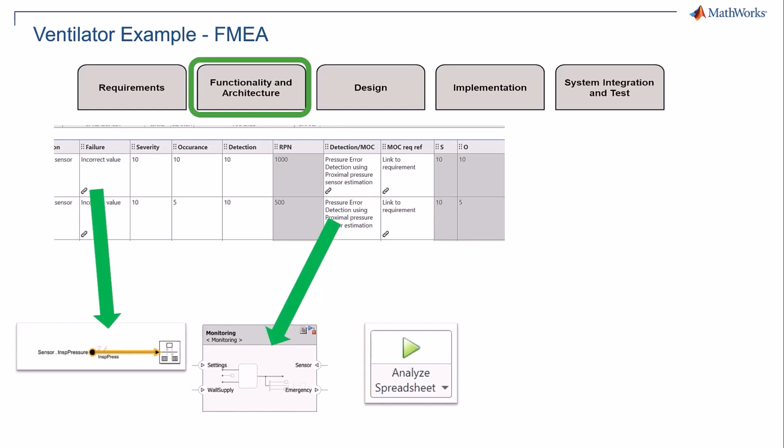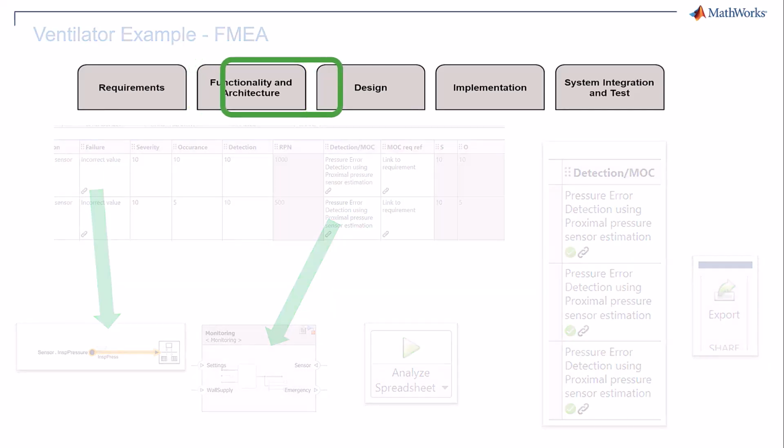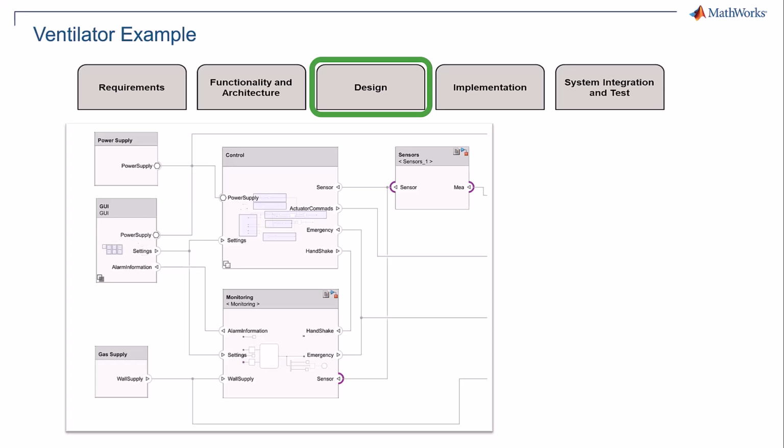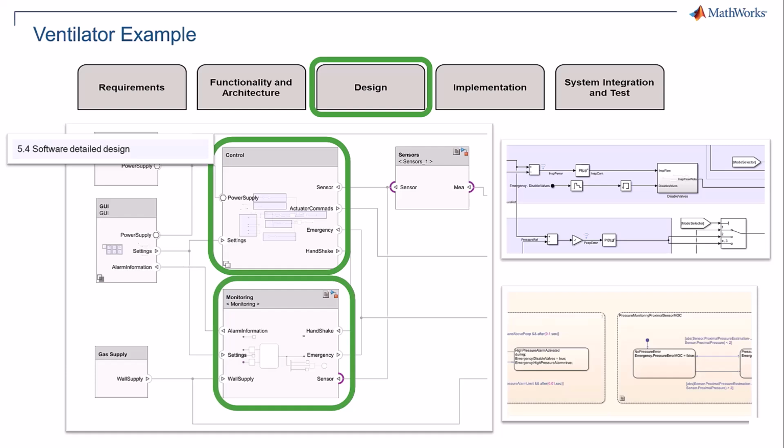When you click the button Analyze Spreadsheet, each detection method is automatically verified using a simulation. And furthermore, you can easily export the result of the automated FMEA as an artifact in your device history file for the US or medical device file in Europe. And regarding Chapter 5.4, Software Detailed Design, this model also includes a control model made in Simulink and a monitoring model created in Stateflow.